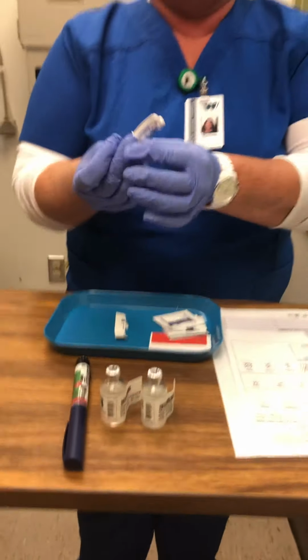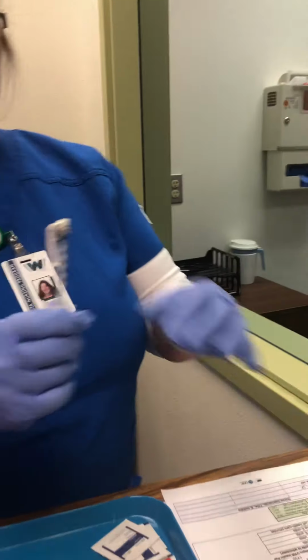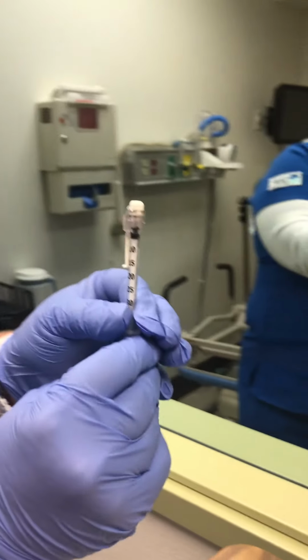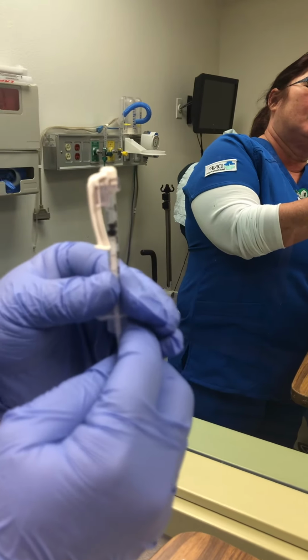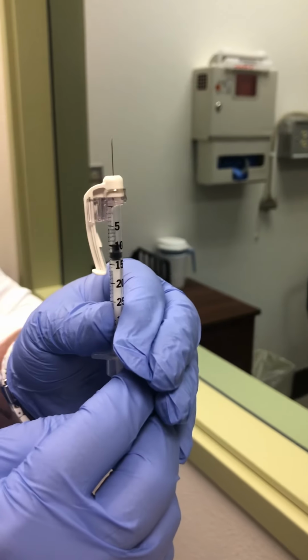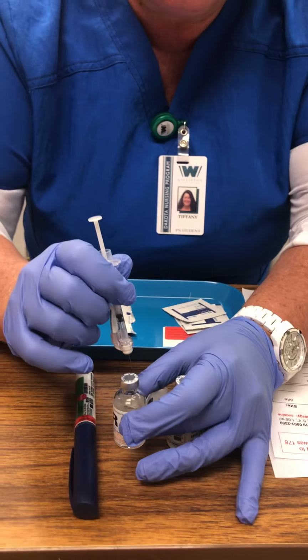Okay, and then I am going to draw 10 units of air for my regular insulin, coming down to 10. There we go. And I'm going to stick that in the bottle.